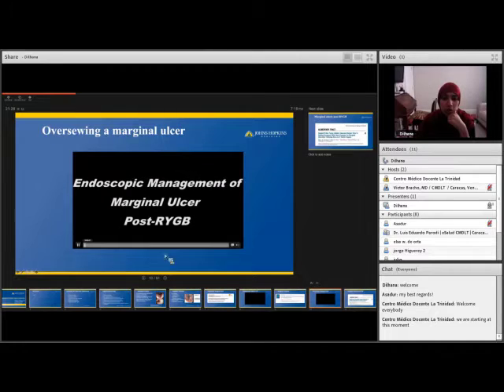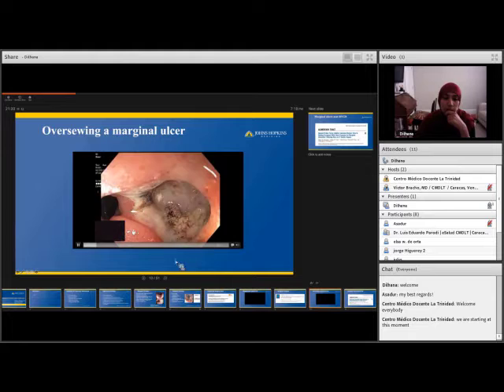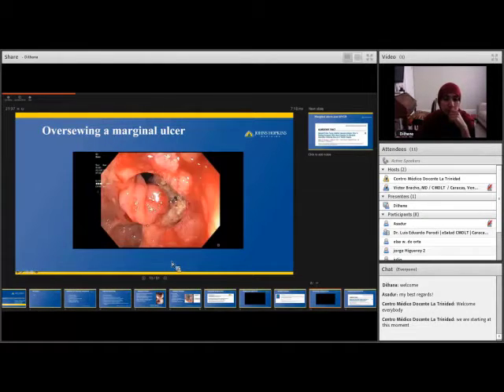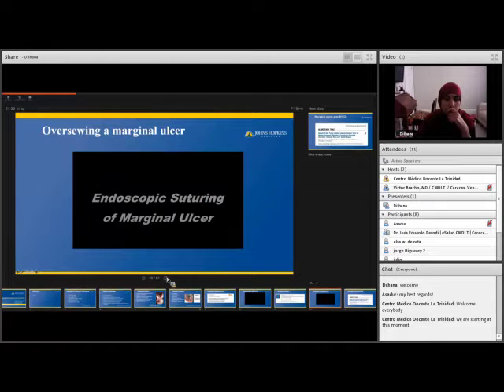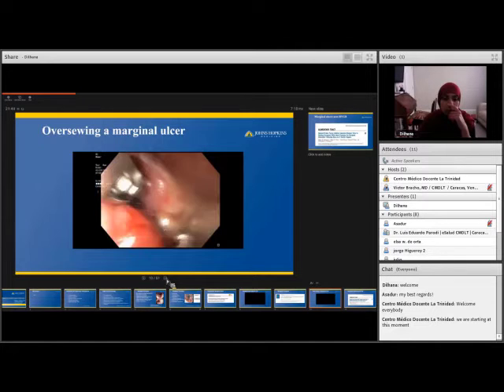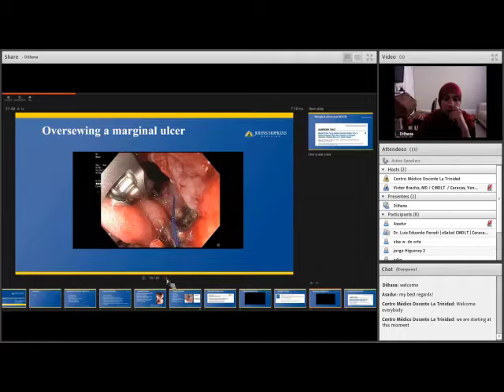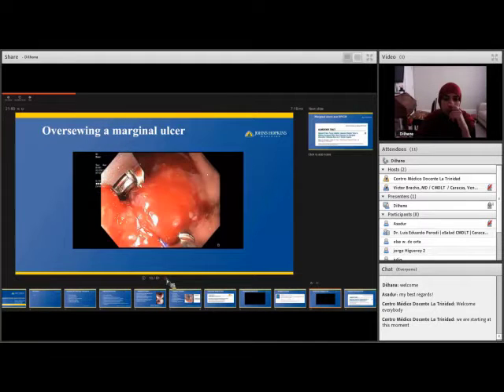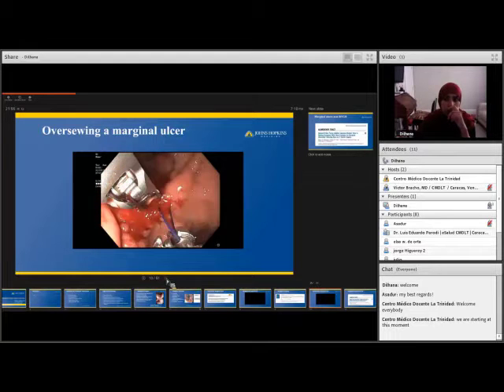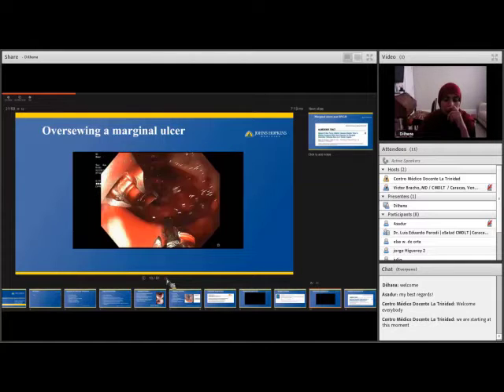And the PPI, as I said before, needs to be an opened capsule or a liquid formulation. And of course, removal of all inflicting factors such as cessation of smoking, H. pylori eradication, as well as removal of NSAIDs. So I'm going to show you this video here. And again, you can see that there's successful management with endoscopic suturing. So here you can see this big ulcer, and we're going to oversew this ulcer in order to get it to heal.